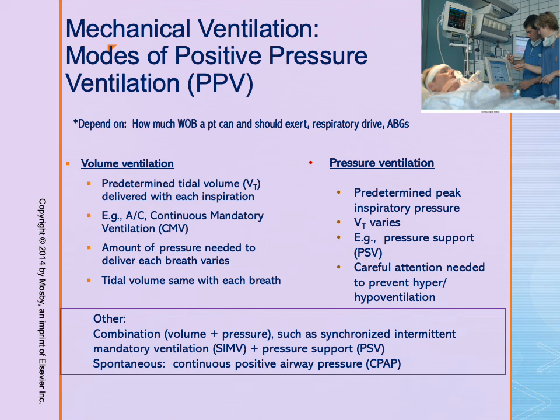So as you can see on the screen, there are several modes. Your book has a chart with about 8 different modes. We are going to focus on main classes. The modes are divided into volume ventilation and pressure ventilation.